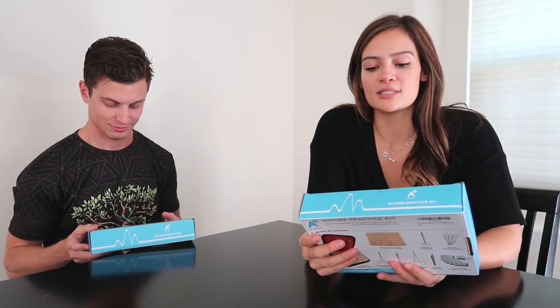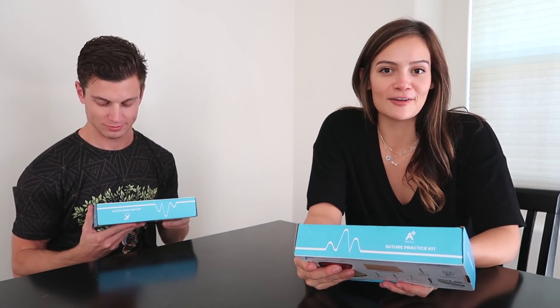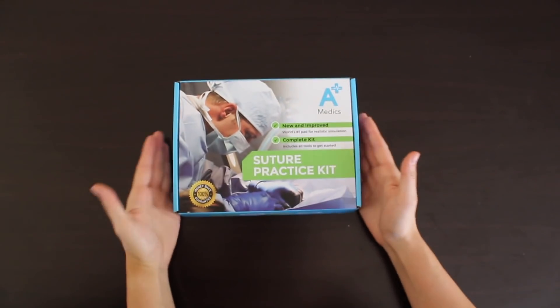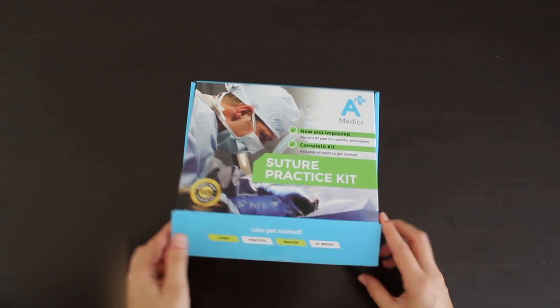A Plus Medics sent me a really cool kit and they actually sent me two so we could practice suturing. I've never sutured before. Zach knows how to suture. We're just going to see how this goes and tell you a little bit about this while also answering some of your questions. So this is how it comes — the A Plus Medics suture practice kit.